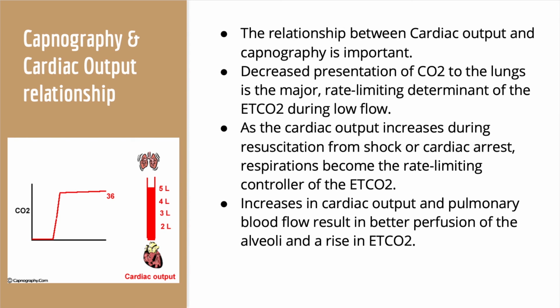Decreased presentation of CO2 to the lungs is the major rate-limiting determinant of the end-tidal CO2 during low flow. So it's just very important to understand how these two correlate with one another. If your cardiac output is increasing, then you know that compressions are effective, and you can also determine that by looking at your capnography waveforms. I think this is super important also because it can guide us on the state of the patient.